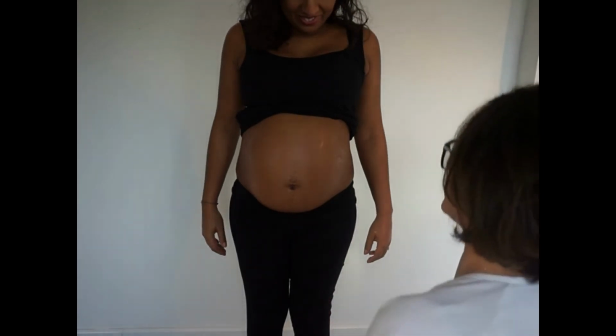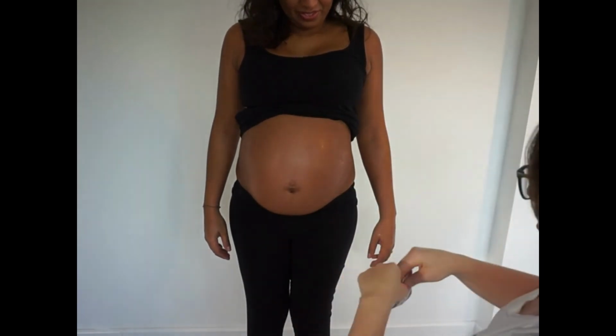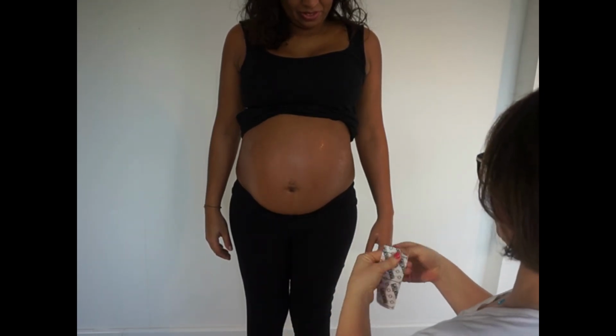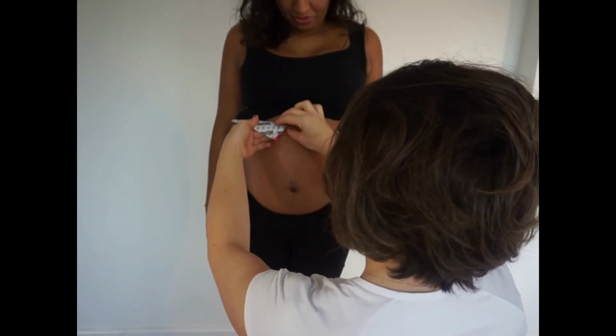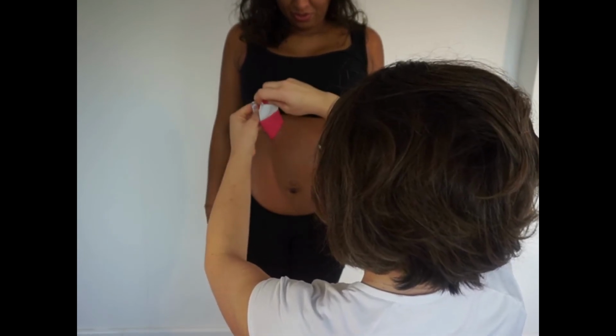Next up is the mechanical support of the linea alba. So usually with the mechanical taping, we would apply a heavy amount of stretch. But in the case of the pregnant client, we don't want to do this. It's important that the growing belly has room, and our intention really here is just to alleviate some of the discomfort over that midline region.